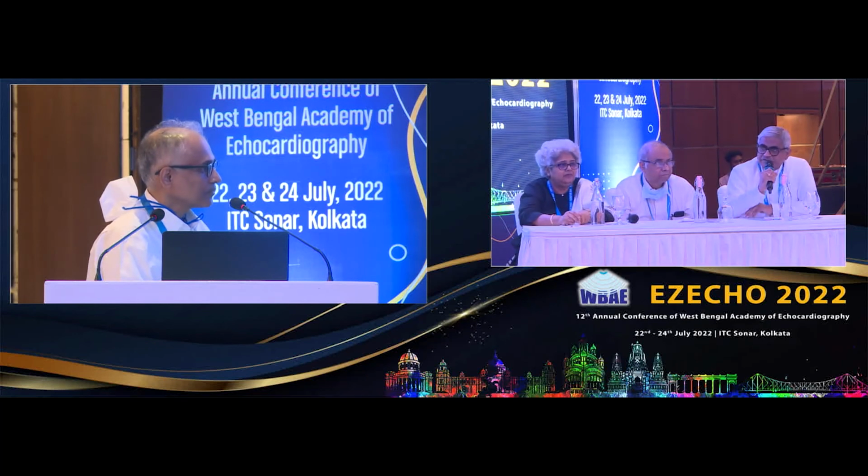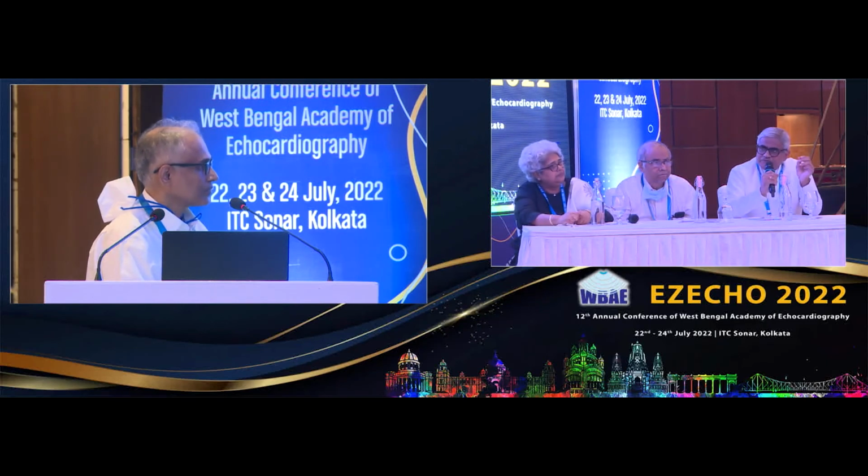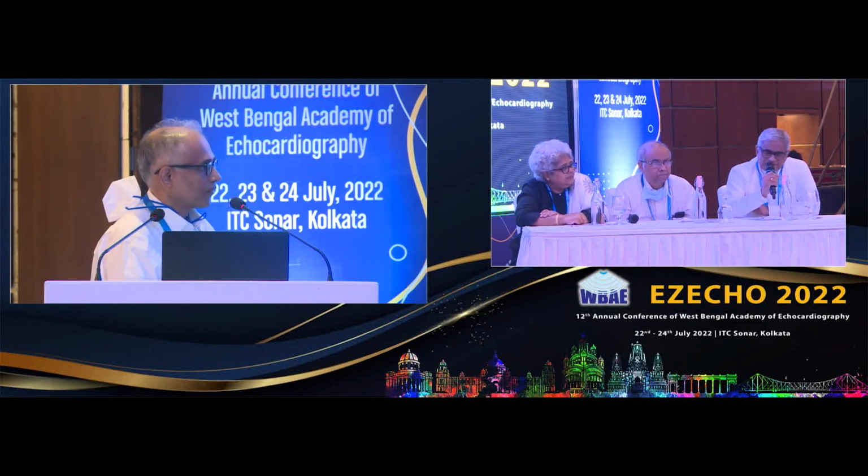Thank you. It's a great presentation. I think the other answer to this question could be that even after the surgical correction of chronic constrictive pericarditis, there is not complete reversal of hemodynamics. It still remains. So the changes will be there anyway, because the echocardiographic changes indicate the hemodynamics of chronic constrictive pericarditis. Very true.